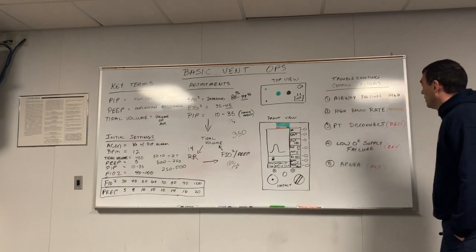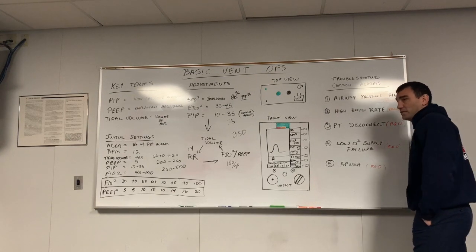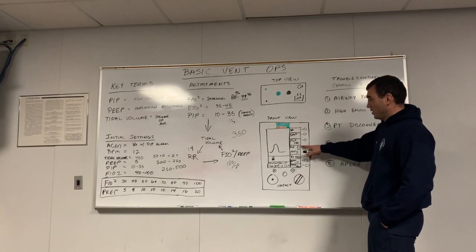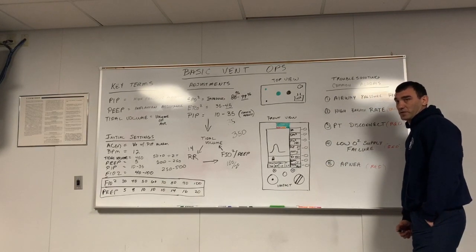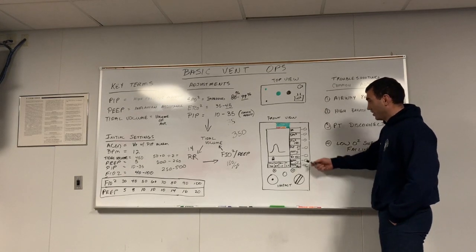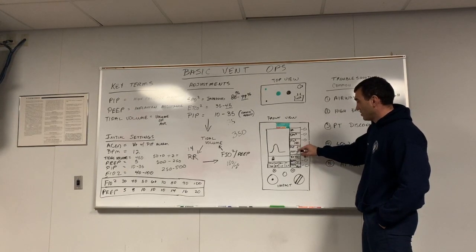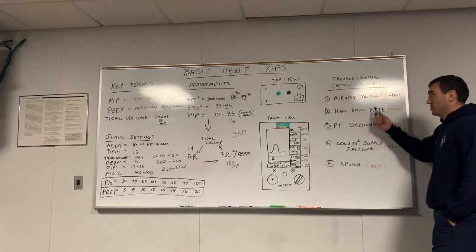All right, so the next is, are you actively doing CPR? Something to remember, okay? A lot of people forget to adjust this during cardiac arrest. So they put the vent on the truck and it immediately starts alarming for airway pressure high. Okay, so if you're in cardiac arrest, this number 35 needs to be changed to 100. So I need to select it until 35 is flashing, run that to 100 and make sure I hit my green check mark, and that should deal with that alarm.